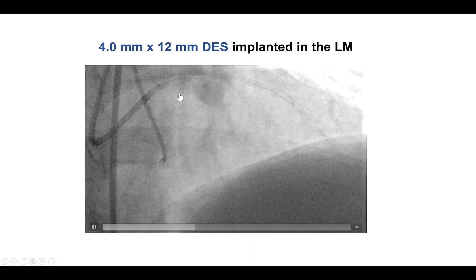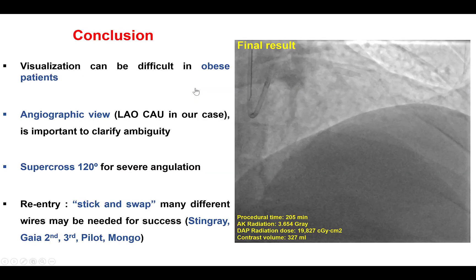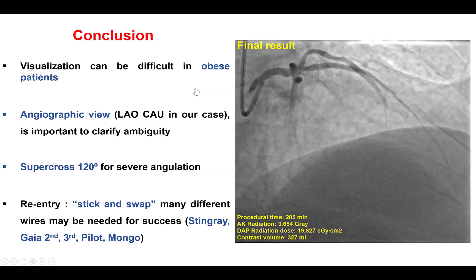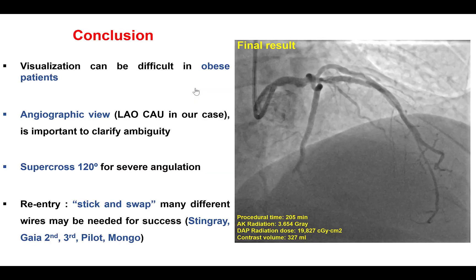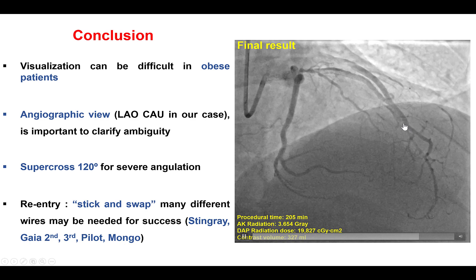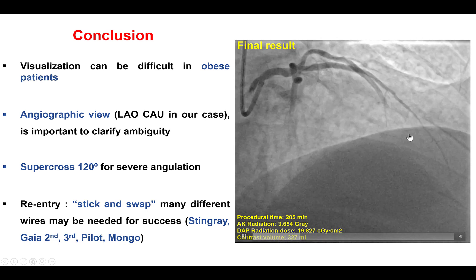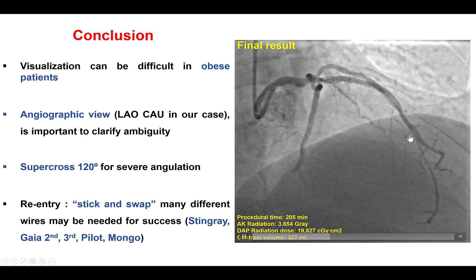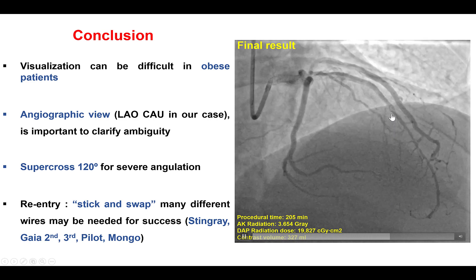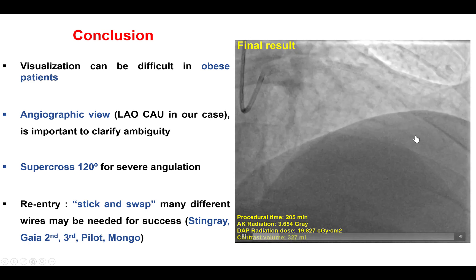Finally, we stented the left main and achieved a nice final result with TIMI flow in the LAD. There was some diffuse disease in the mid-LAD which we elected not to stent, because the CTO vessel often grows after the vessel is re-canalized.